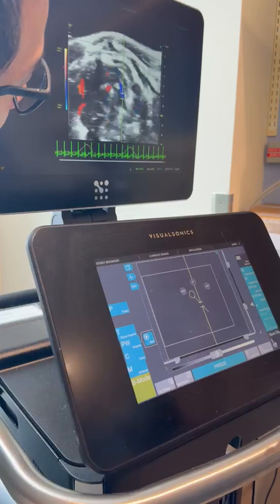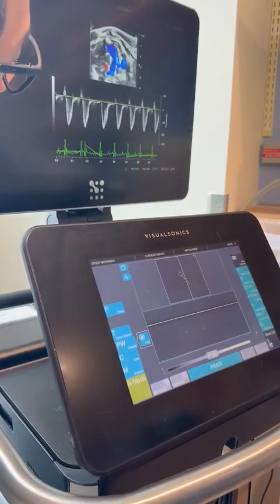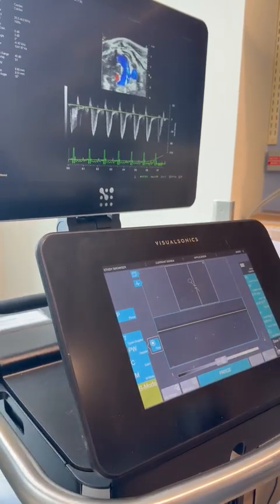Okay, and then hit start. Very nice. And then you can save that. There's laser sound effects.